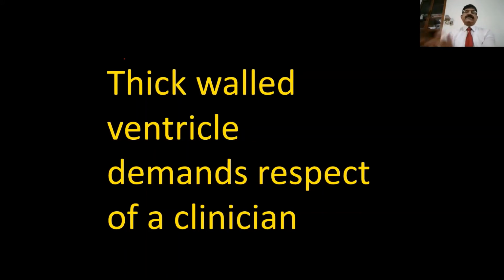So the current theory is a little different. The drag is not a venturi, it's a non-venturi drag of the entire mitral apparatus, and also the curvature of the septum plays a role.